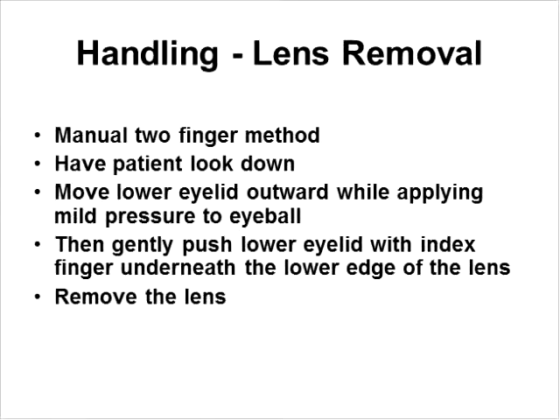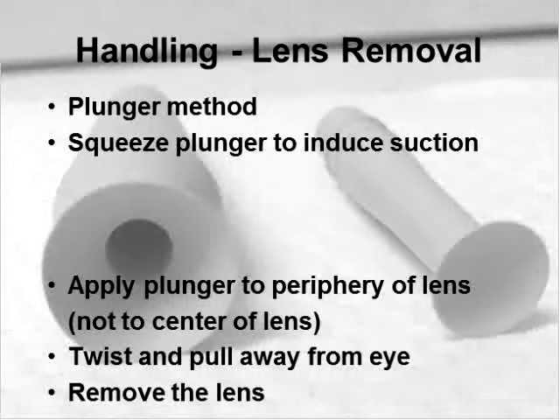For removal, it's possible to remove the lens with a 2-finger method. In this regard, you have the patient look down, you move the lower eyelid out while applying a little pressure, and then gently push the lower eyelid with the index finger to remove the lens.